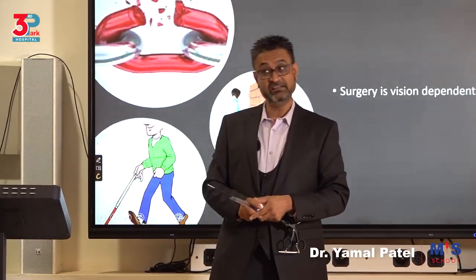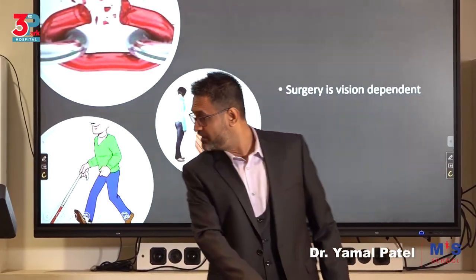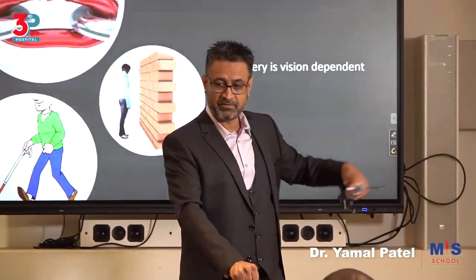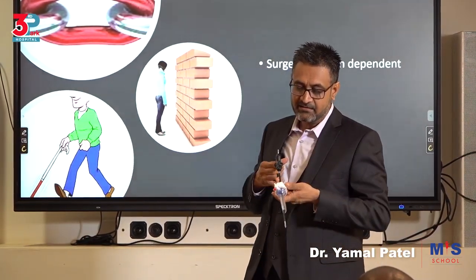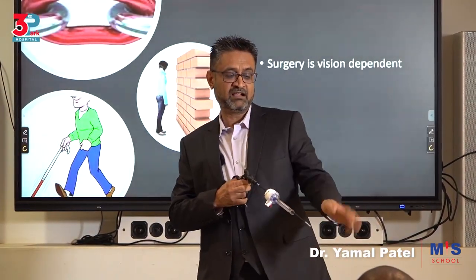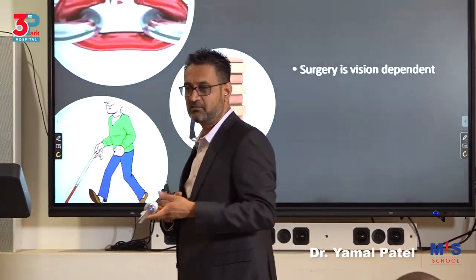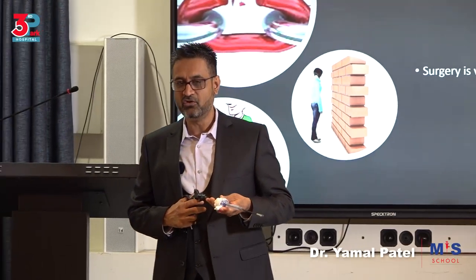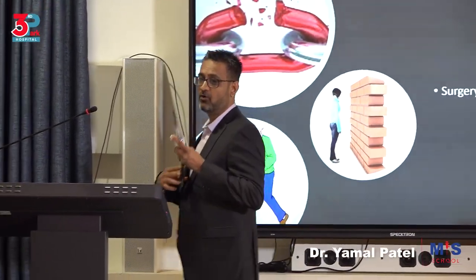In an open surgery, it's different. You have a big vessel there. You just go and put your hand there, and then you'll be looking for whatever you want. Okay, get me a mop. Get me. You won't have that type of time. If you think that you have a bleeder and you're just going to suck out and then think you're going to hold it, my friend, by the time you'll hold it, that person would have bled half a liter. So you have to be more alert. If you can't see properly, you can't operate.